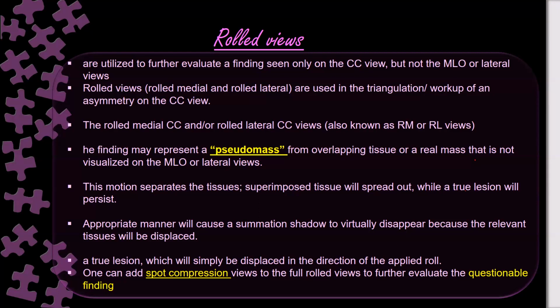Because if I move it into a denser breast, or where there is superimposition by fibroglandular parenchyma, it might give me what? An erroneous effect, because I could not visualize it, not because it disappeared, but because it is obscured by the overlapping tissue. So I try to move it into an area of fatty tissue. This is one principle. The other principle is the movement itself. I will give you examples.